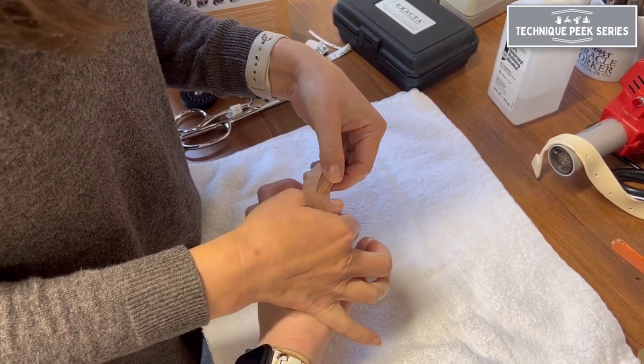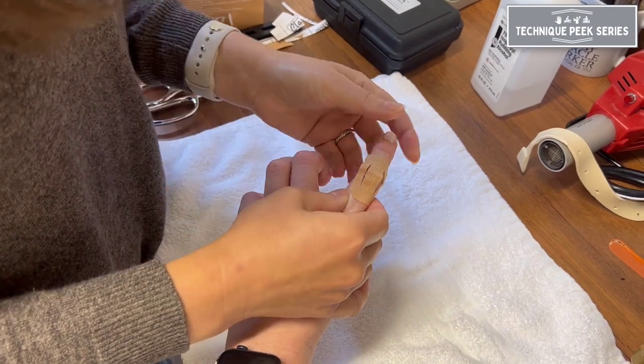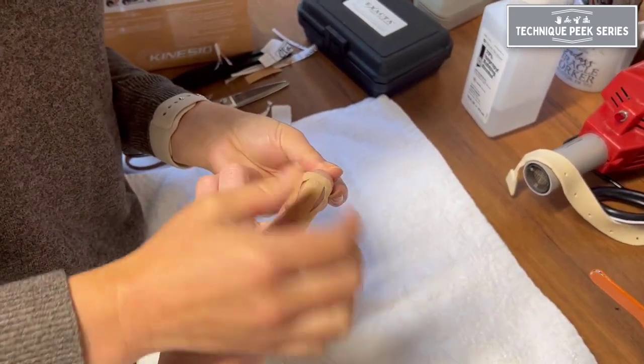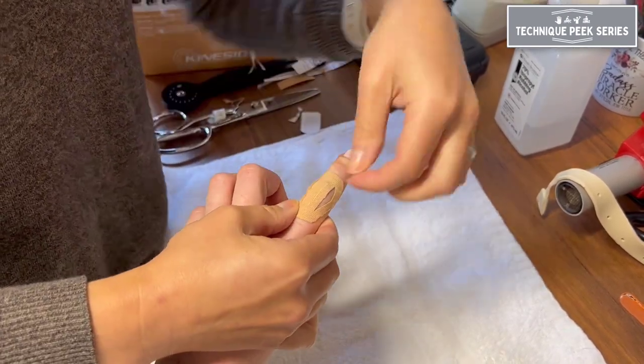When applying the tape, begin with the patient's finger in a flexed position. This will decrease excessive tension on the tape during active flexion, and it will also create ripples in the tape during active extension.